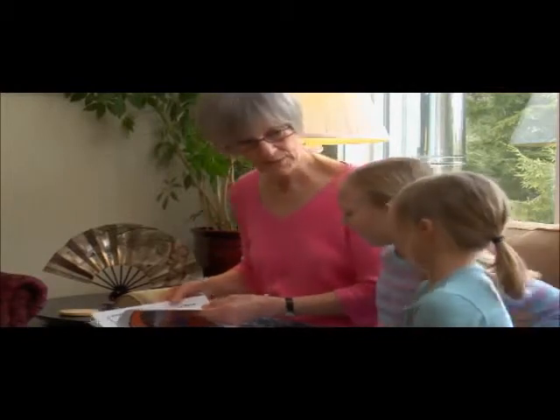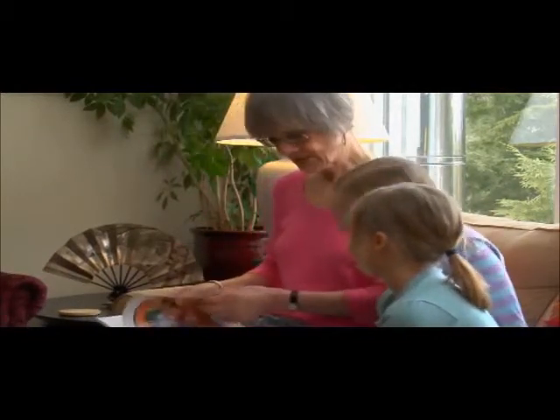Don't let arthritis or sore joints compromise your quality of life or the quality of life of those you love.